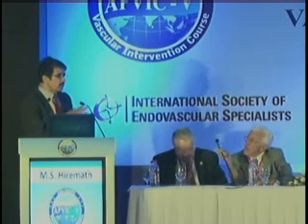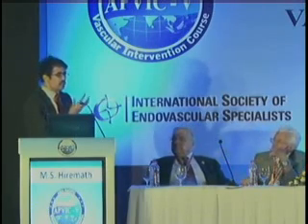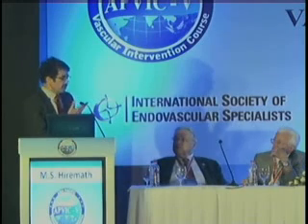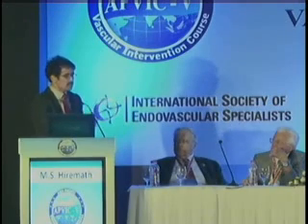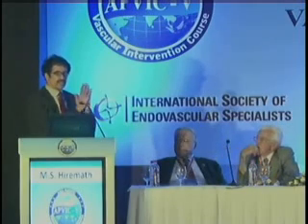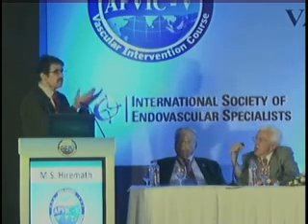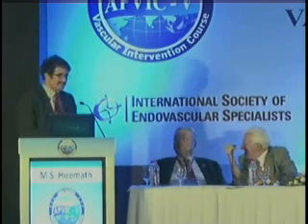Yeah, I have never put one, but my feeling was just as in coronary, if you have a heavily thrombotic vessel, we put something like an M-guard stent. Even for carotid, is it a recommendation to put covered stent if you see a big thrombus? No. The feeling is as you expand the stent, you'll probably be able to hold the thrombus at that local site and there will be no distal embolization. No, if you see a big thrombus, I think that the surgeon is better. Get your knife out.